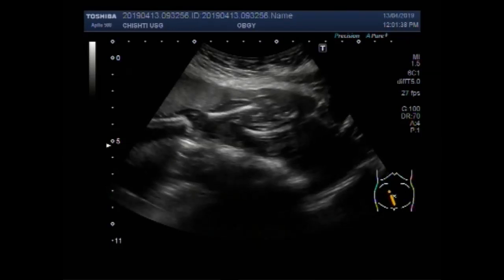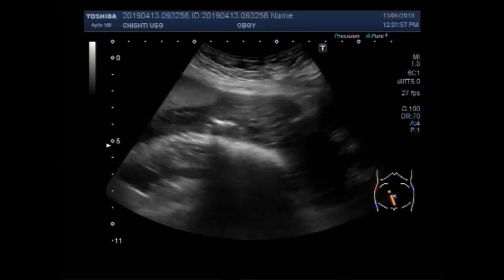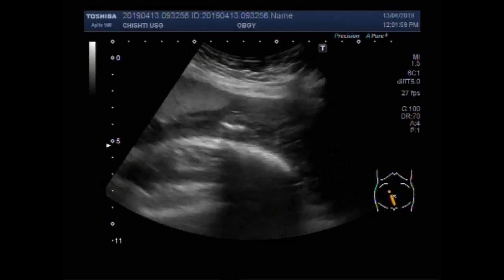These are both femurs. You can see there is no fetal limb movements.